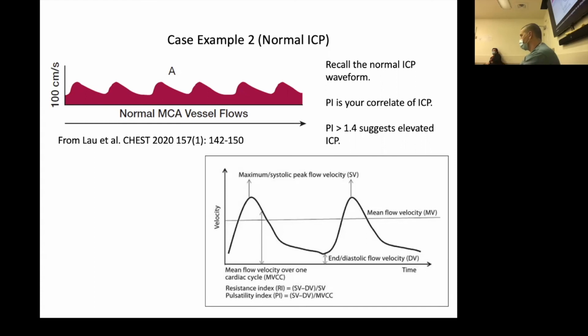It does. Does that mean when you would do a scan and then a second scan, you would see it worsening, or is it good enough that you look at it, say that PI is bad? I think we're getting to the point where that is what it's become. I don't use TCD in isolation. I sort of hinted that we use ocular ultrasonography. So if I see an MCA waveform that looks sinister, and then I see an optic nerve sheath that looks big, I say, okay, mannitol, 3%, whatever, neurosurgery.